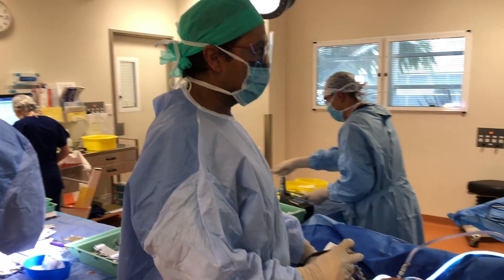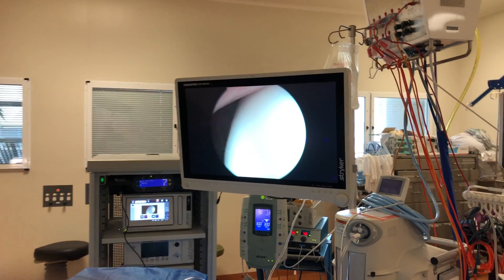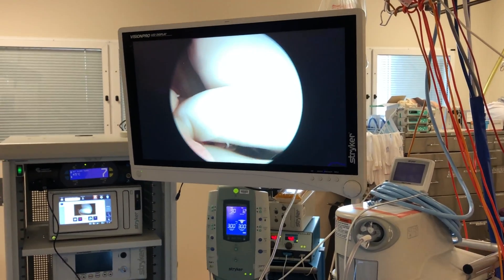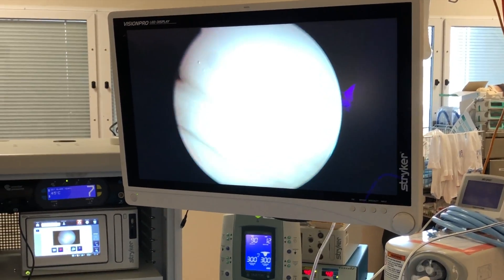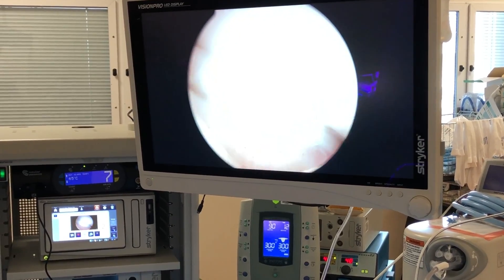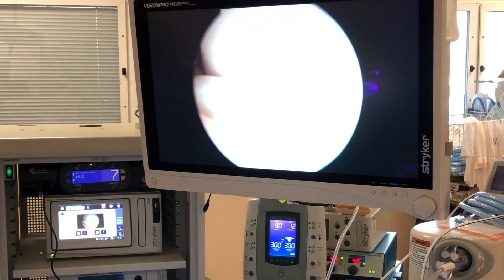We now do the arthroscopy to start off the case. If you look on the screen, that's the medial femoral condyle and as I'm coming through into the joint space, here's the locked meniscus. As I extend the knee, you can see the meniscus is now jamming between the femur and the tibia at the bottom.